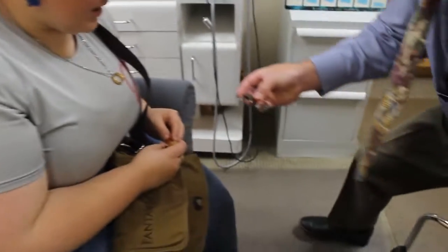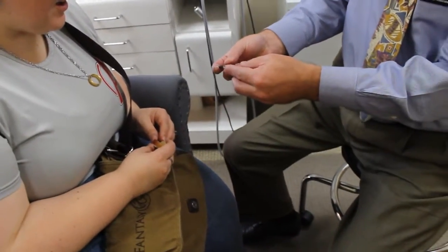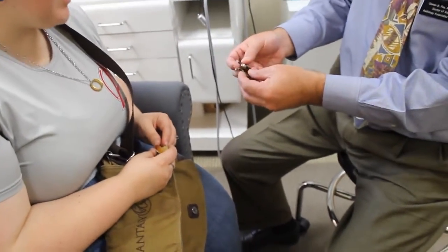Now, the new devices have markers on the inside so that you can tell the right one from the left one. There's red and blue. Which one's left, which one's right? Right is red. Right is red.